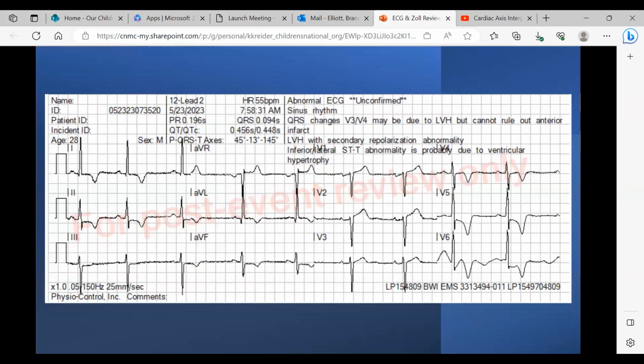So I recently had a preceptee ask me why it's important, because no one seems to know. The way I explained it is we know that left bundle branch blocks are bad, especially if they're new, that could be a sign that there's cardiac damage, there's something bad going on. The left bundle branch consists of two fascicles, so two pathways that go down into the left ventricle to depolarize it.